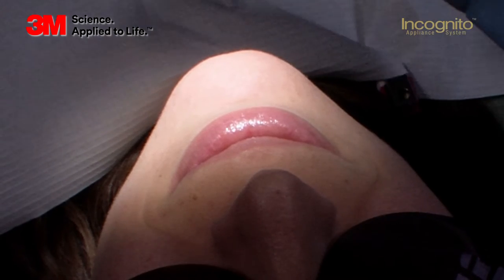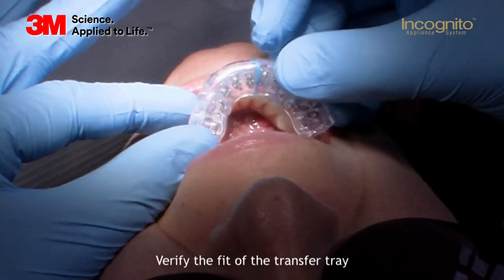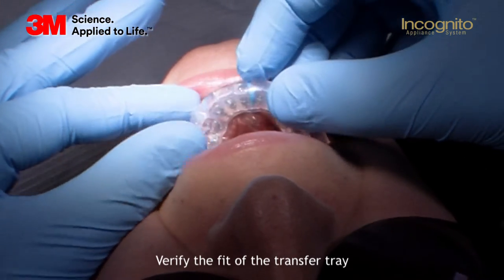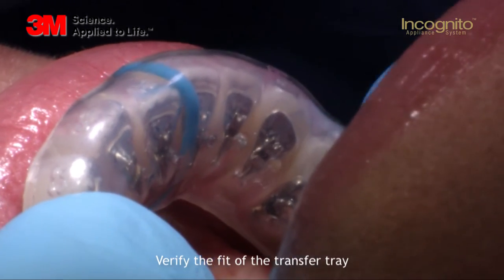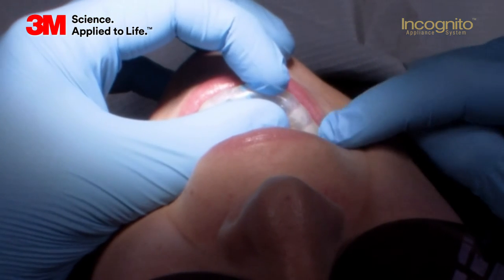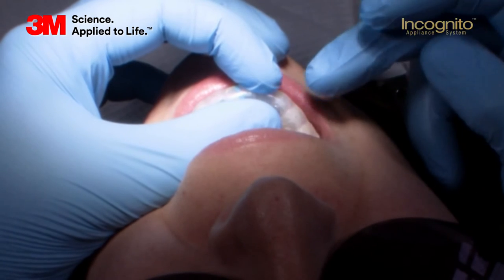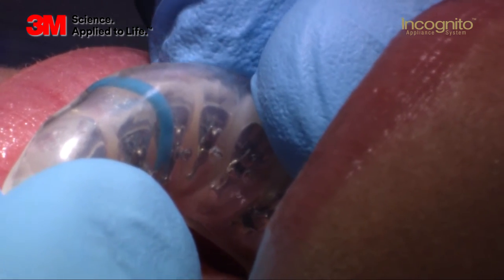Before we can start, I have to make sure that the tray fits really well in the lower arch. The blue line indicates the midline of her lower arch. Position the tray and, as you can see, it's fully seated in the lower arch and perfectly seated. A real beauty about this tray is you can also double-check if the contacts of the bracket base touch the surface of the teeth. Always make sure that the tray fits before you bond up the case.